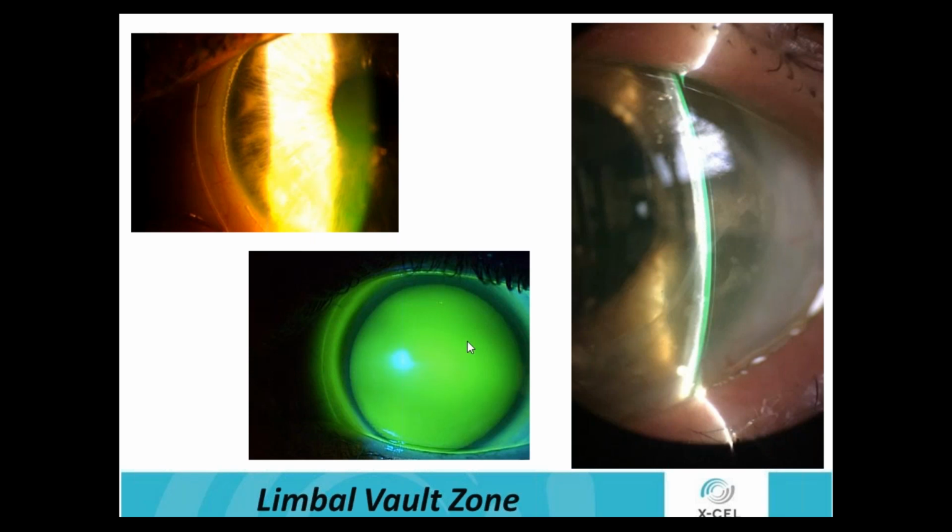So you need to know how wide that band is. If I do make a change in that limbal zone, I want to make sure that it's going to be over the area that's bearing here. So how wide is that and how much can I move that up or down? Again, most of them will work independently, so you really don't have to worry about it changing this central area or that edge. And you can see here, it may be difficult to see, but this is where we've increased just that limbal zone. We haven't touched that central zone, but just in that limbal area, see this nice area where all that fluorescein is? We've increased it there. We've exaggerated it just to show that you can increase just that zone.